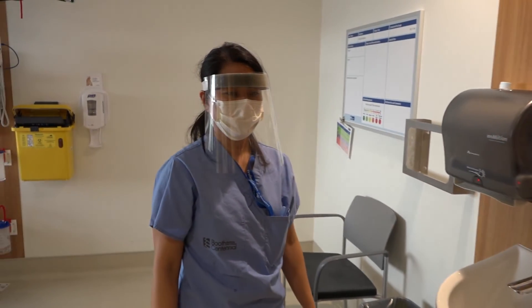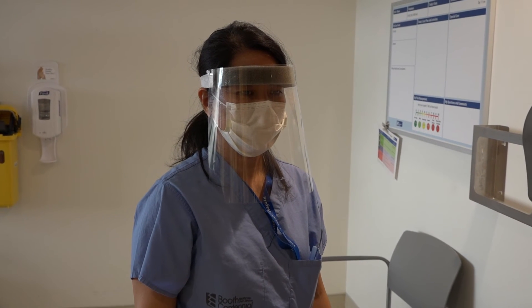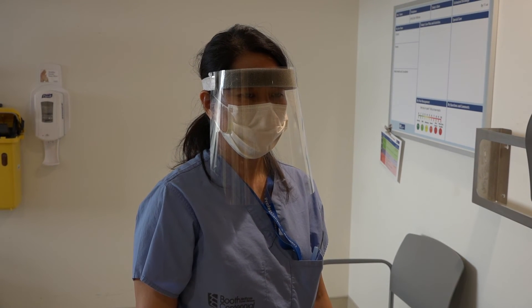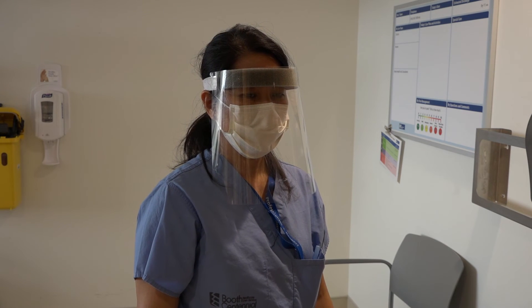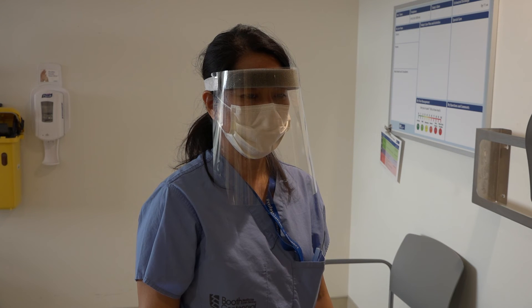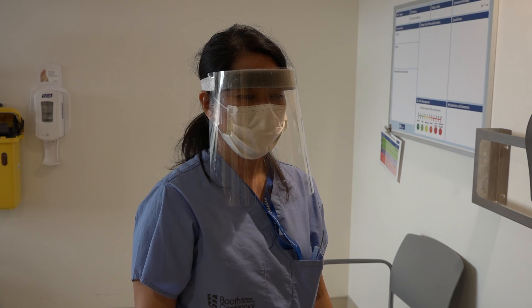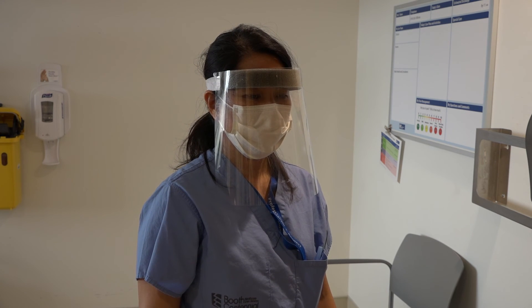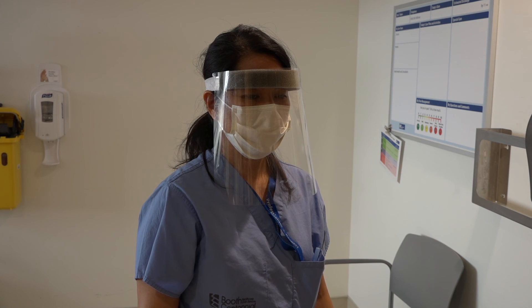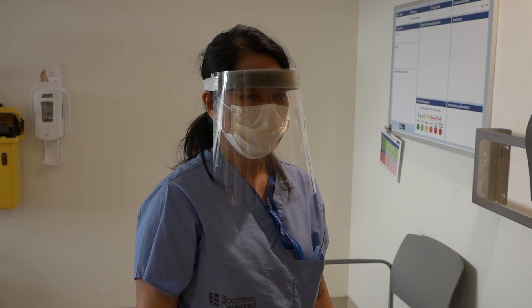She is now ready to leave the patient's room. Note that she can clean her visor with a cavi wipe. She does not need to change the procedure mask as it is behind the visor protecting it from contamination. If the visor becomes soiled such that it cannot be cleaned, or if the procedure mask becomes soiled or wet, she should request a new one. This completes the doffing procedure for droplet precautions.